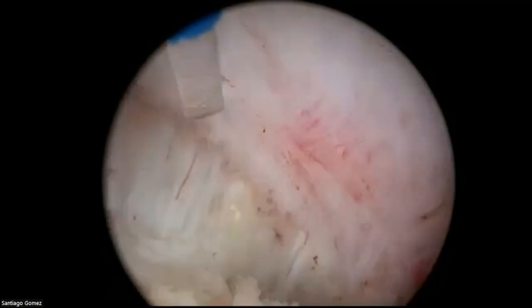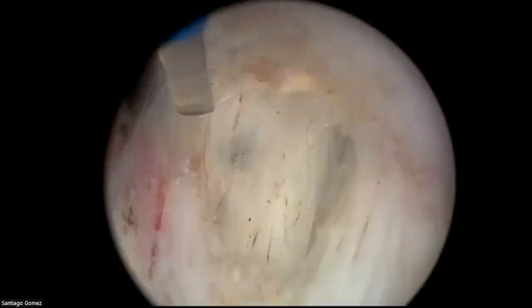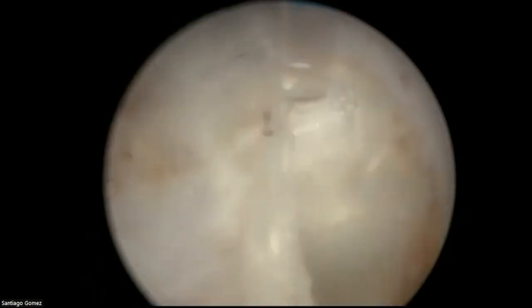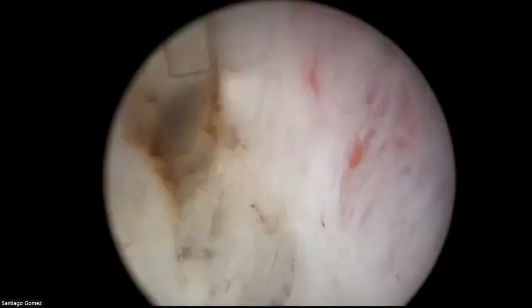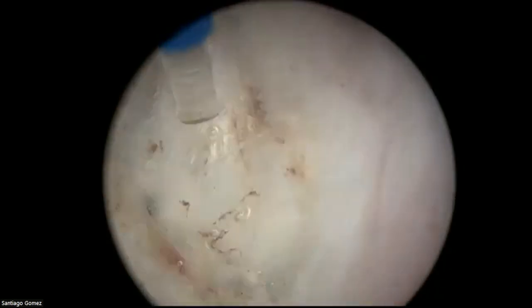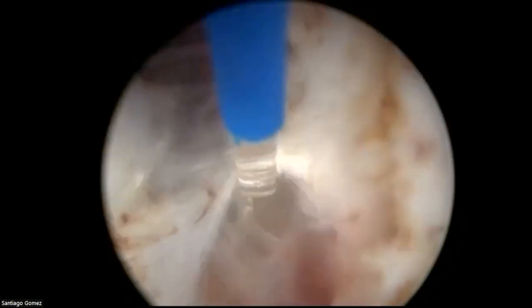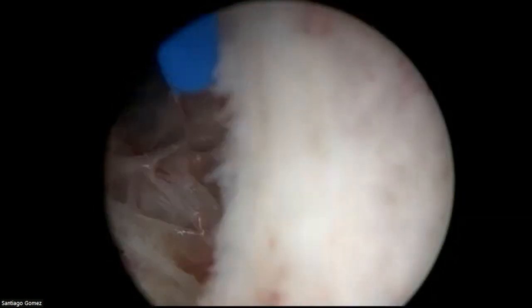Okay, so here you see we are looking at the circular fibers of the bladder neck. Below this, we have the vertical fibers of the bladder neck. So I'm going to deepen. Now I'm going to cut these vertical fibers because I know that the bladder is behind. This is the anterior commissure here. We're cutting the bladder neck now. What we see here is probably muscle fibers, submucosa, mucosa of the bladder. And now I'm trying to follow the curvature of the fibers of the bladder neck to continue with the dissection. Here we are.